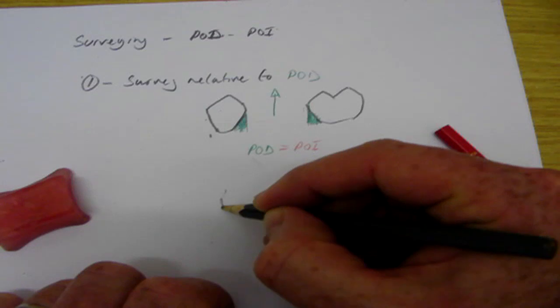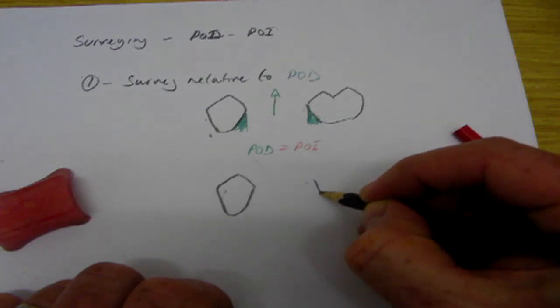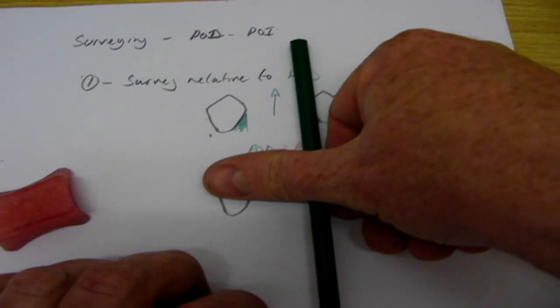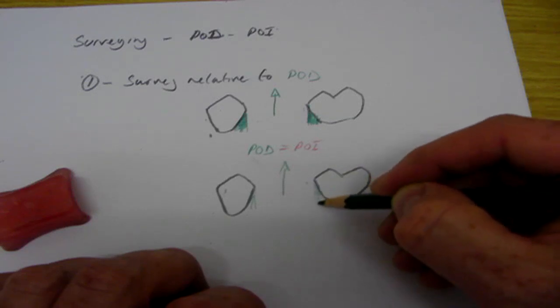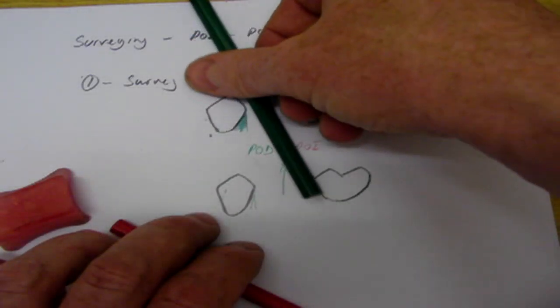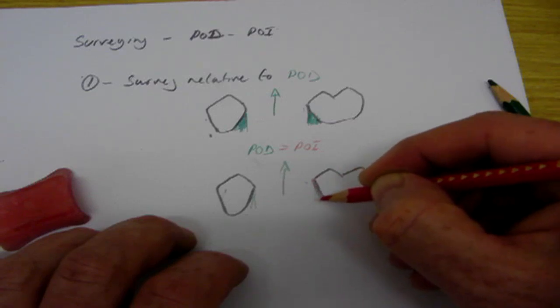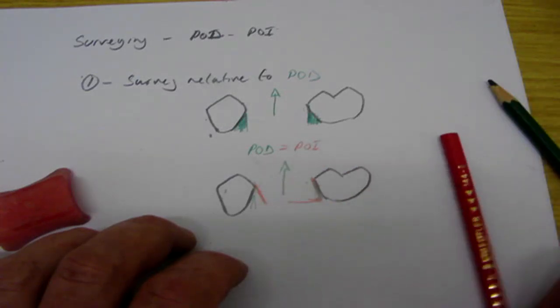Same scenario, we can take our surveyor arm, find the undercut relative to the path of displacement, like so, tilt the model on the surveyor and survey relative to the path of insertion, or create a path of insertion so that the denture is going to slot down this mesial aspect and fill all this area here with denture.